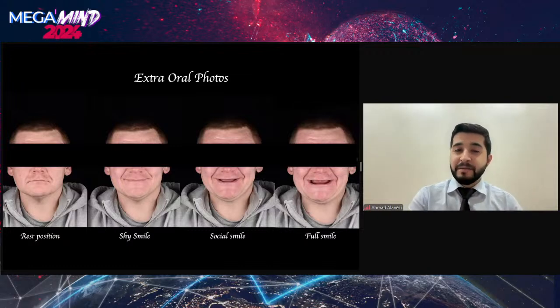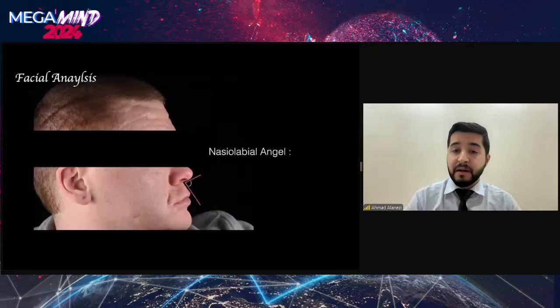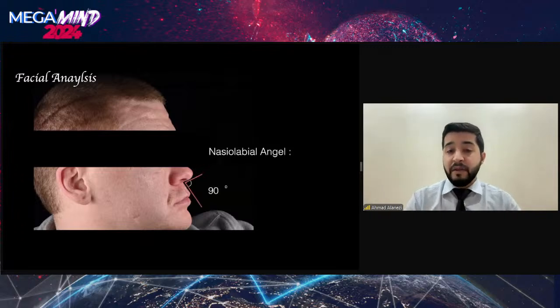I'm walking you through the thought process of what we do when planning a case like this. Facial analysis is important. We found that the lip support to the nasolabial angle is within 90 degrees without the prosthesis, which is a good number.